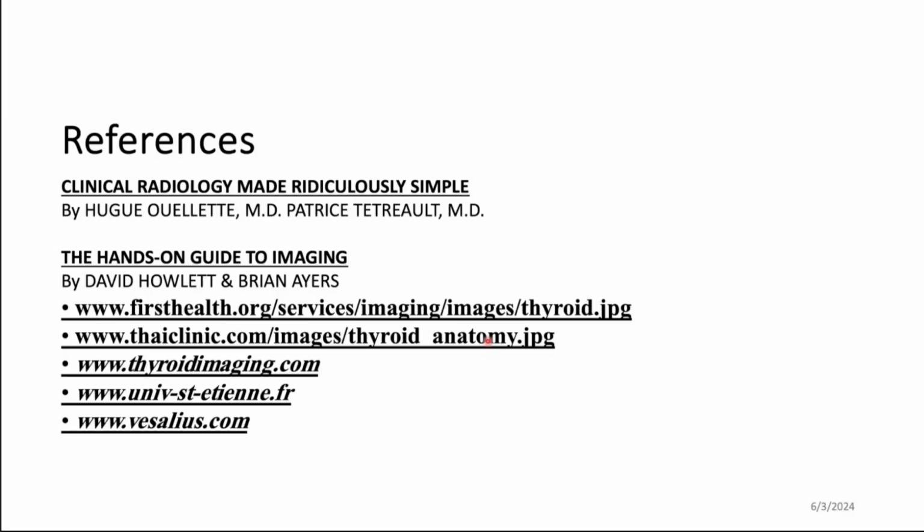Yes, it is similar. It's nuclear medicine. Radioactive iodine uptake, so it's a longer name. Thyroid scintigraphy, radioactive iodine uptake. It depends on the radioisotope that is used, whichever of the available options they use.